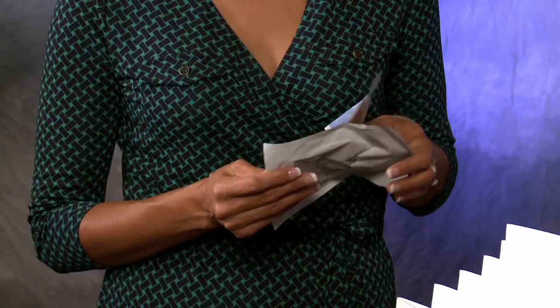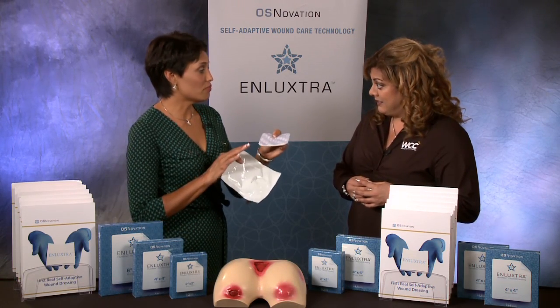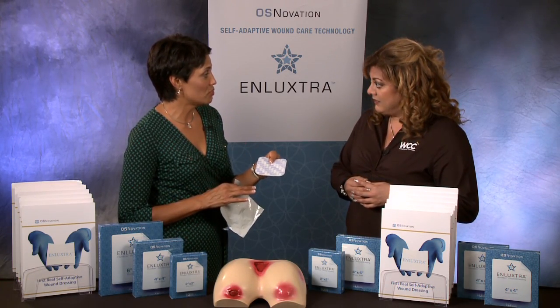What I love about this dressing is the fact that I can prescribe one order for any wound anywhere — use it from the beginning and the presentation of the wound throughout all the healing stages without having to add or change anything to the wound care orders. Are you saying from start to finish, on any wound? On any wound. How does it work?